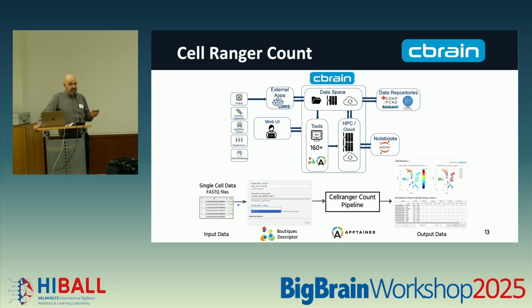And then you visualize the output, depending on the nature of the pipeline. The output might be visible directly within the browser. In this case, the output would normally generate, in this particular application, an HTML file with some visualization of the results. Because of the various formats that we support in CBRAIN, this is all directly viewable in your browser. You don't have to download it to your local computer, visualize it there, and then go back and forth. Everything is directly workable within your web browser.